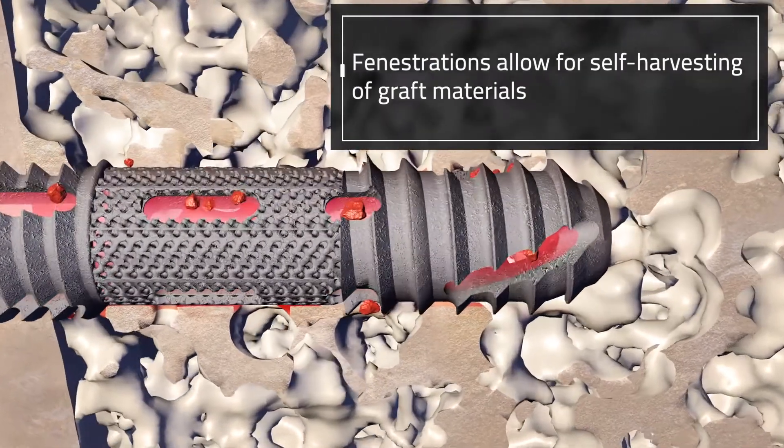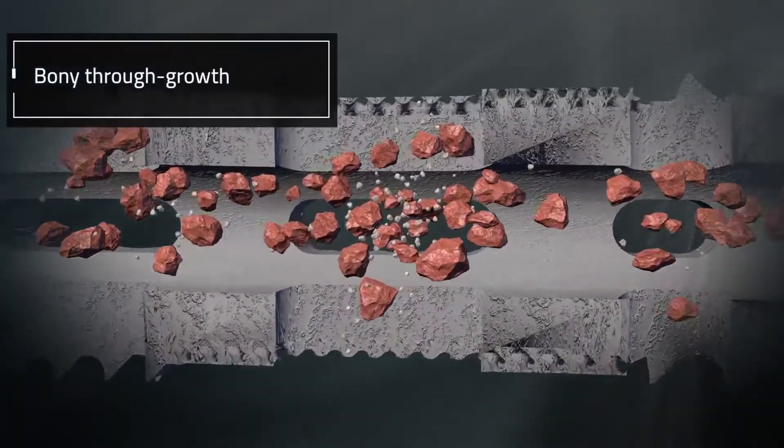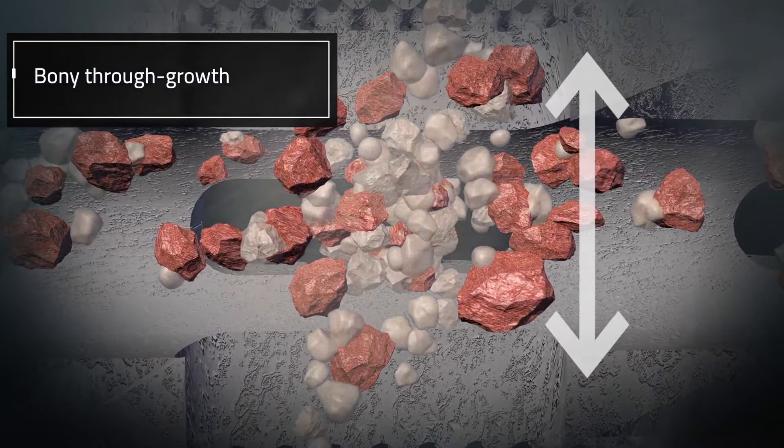Fenestrations allow for self-harvesting of graft materials and bony through-growth, creating a bond between the implant and the patient's bone at the SI joint.